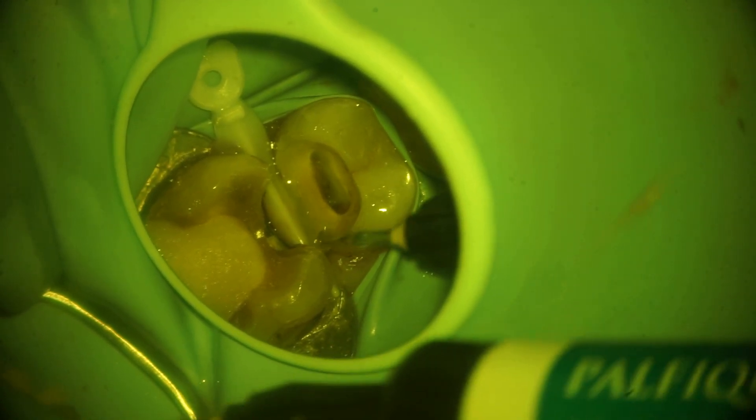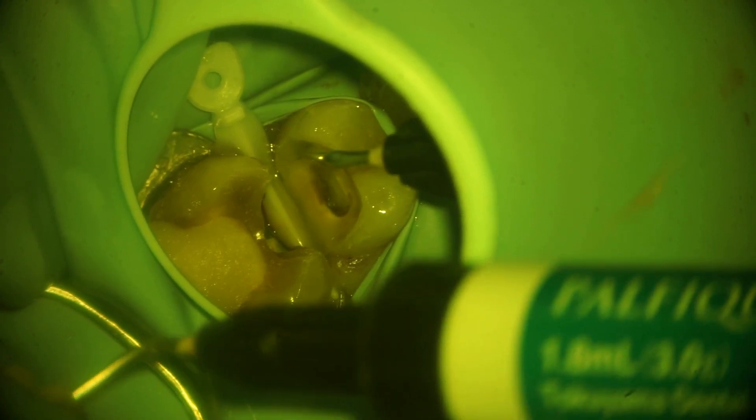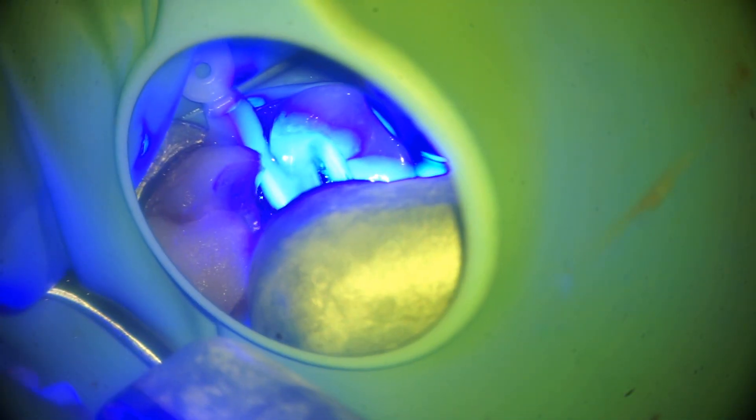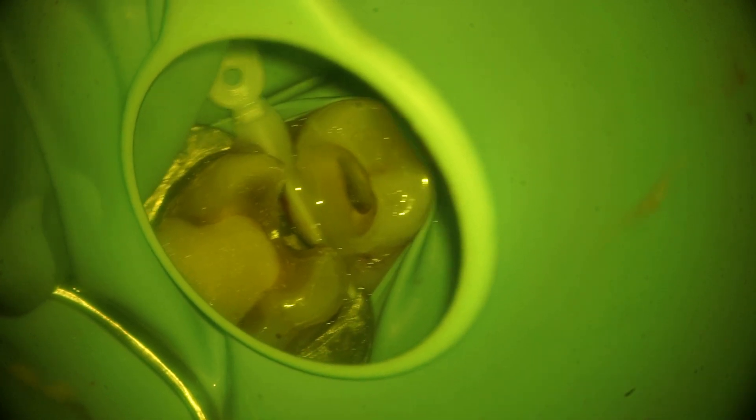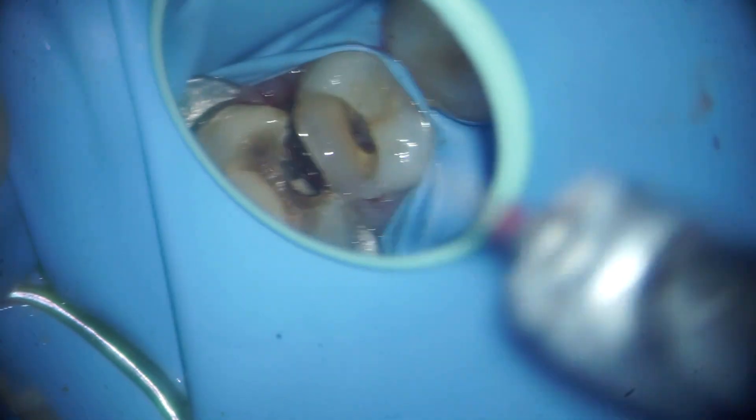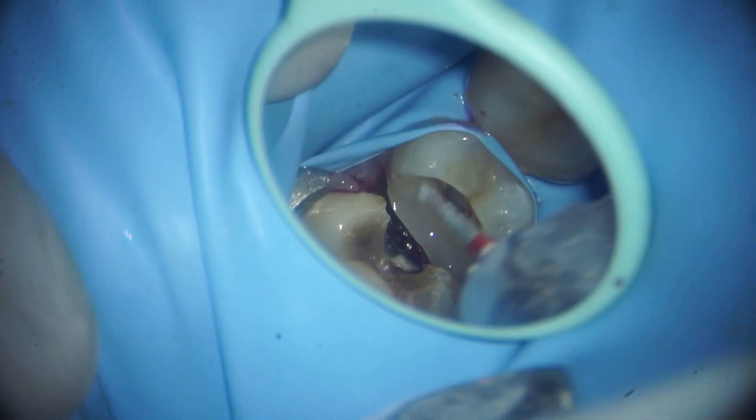Now we are using a bulk flow composite to increase the height of the gingival seat. We just push and flow the bulk flow to increase the vertical height to the crest of the wedge. Now we are curing the bulk flow composite. After removing the wedge, you can see that we have elevated the margin well above the level of the gums.